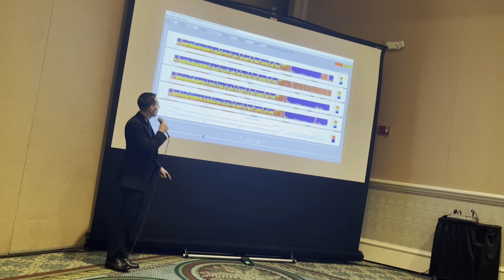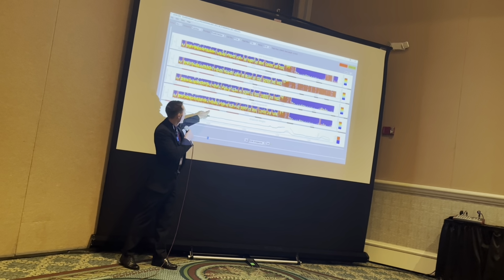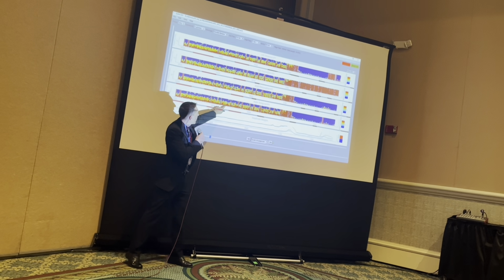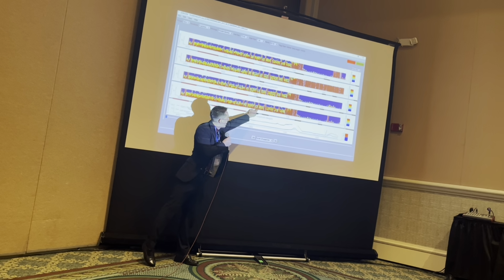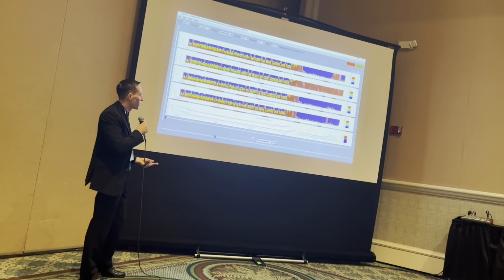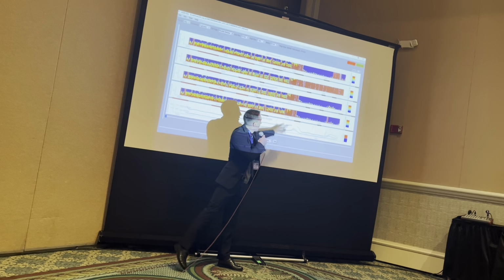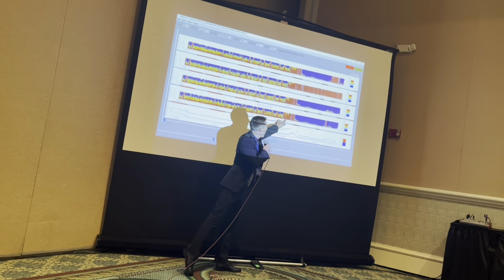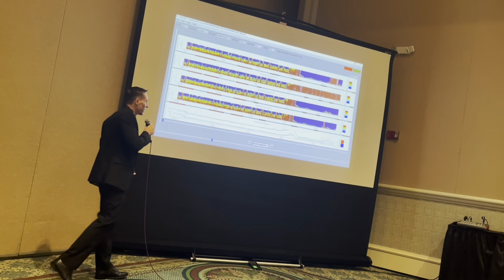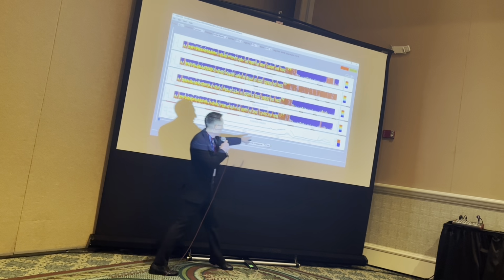These interictal discharges are shown by these little choppy flames: very short, quick discharges. So you can count and quantify the number of interictal discharges the patient is having. And then also, near the end of this record at 12 minutes, you can see the start of a flame here, and that is the start of a generalized tonic-clonic seizure, with the amplitude going way up, off the charts.